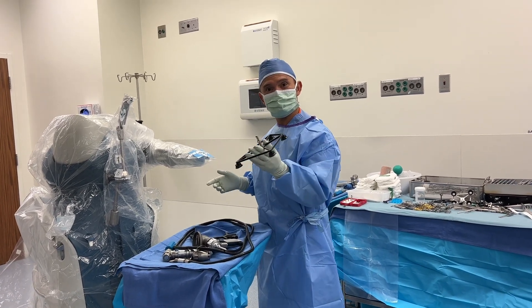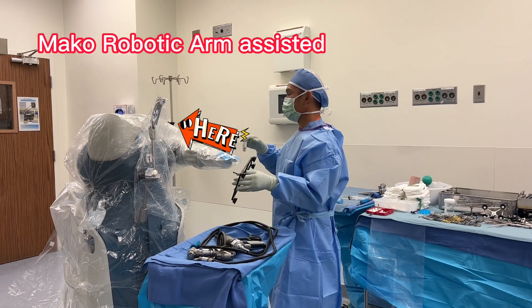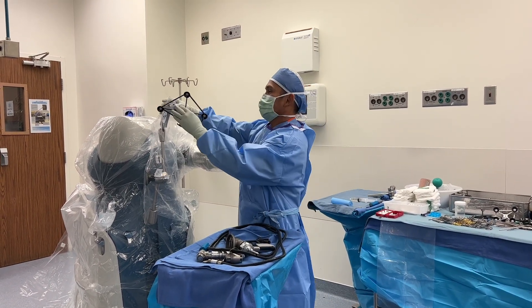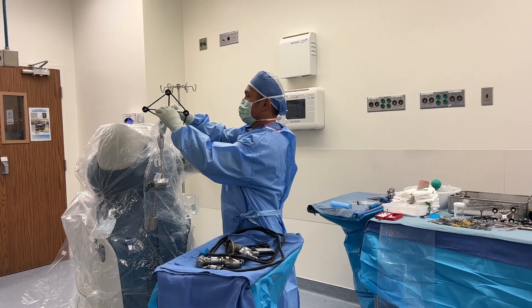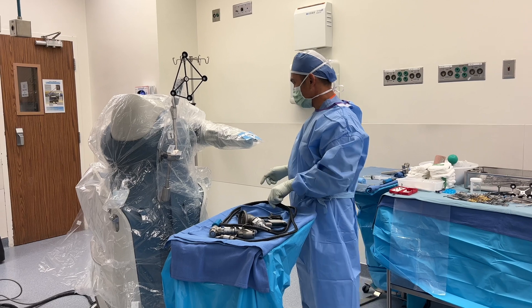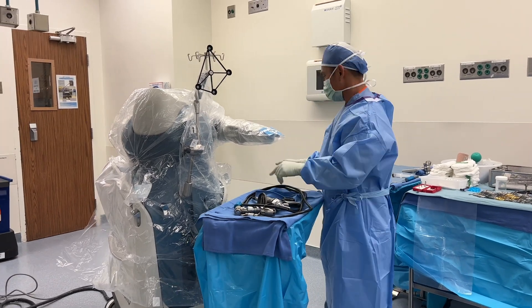We're doing a left totally MAKO arthroplasty. So this is the robot. We're going to put this array right here. I already rigged the MAKO robot, so I'm putting all the attachments on now.